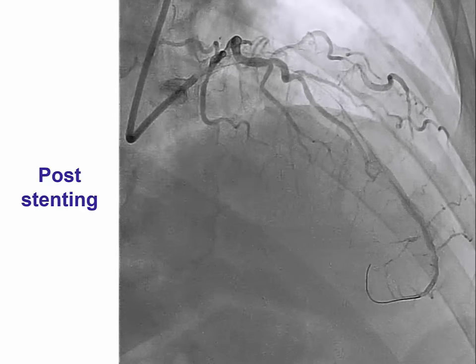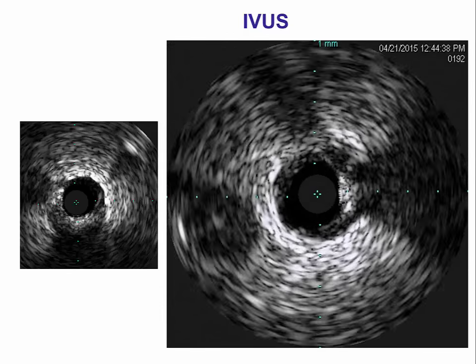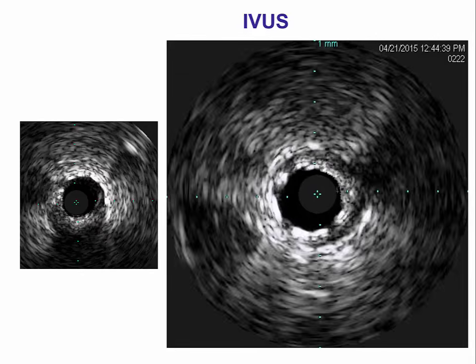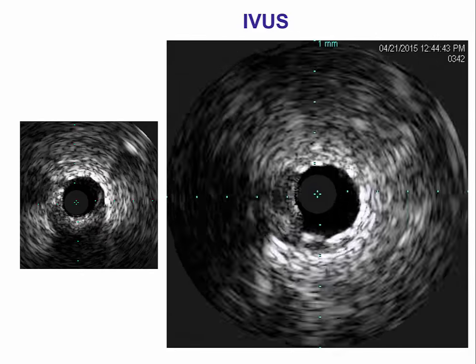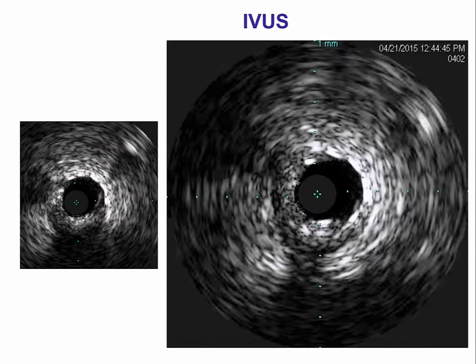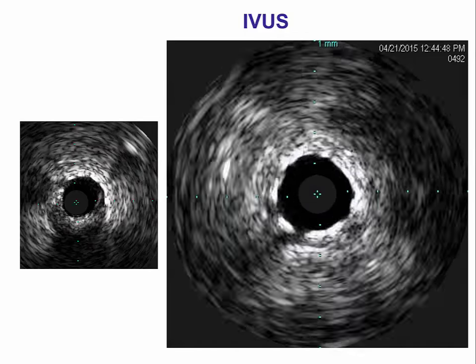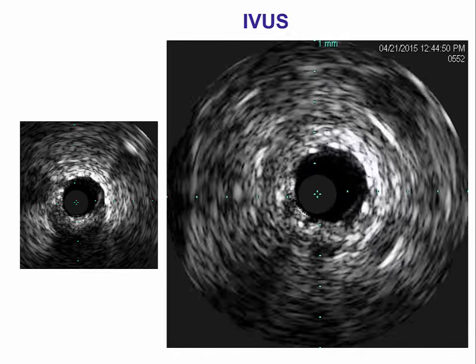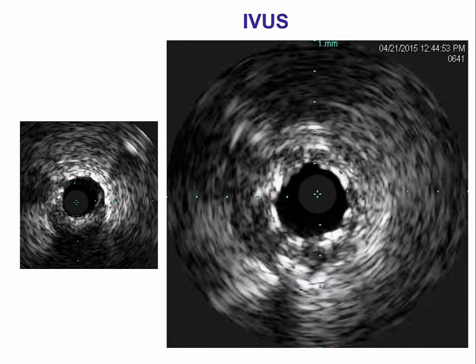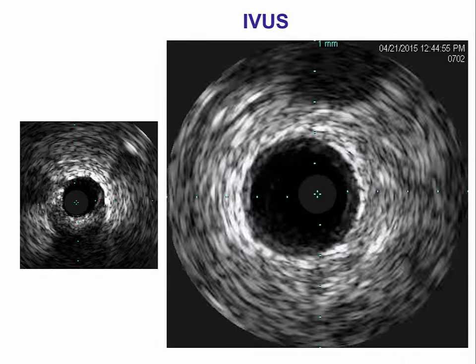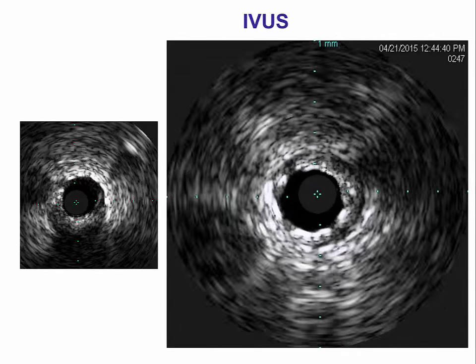After stenting, the angiographic outcome didn't look bad. However, we performed intravascular ultrasound, and what was obvious under IVUS is that the patient had some areas of underexpansion within the distally deployed stent. As a result, we decided to perform further stent optimization by doing some more high-pressure balloon inflations.